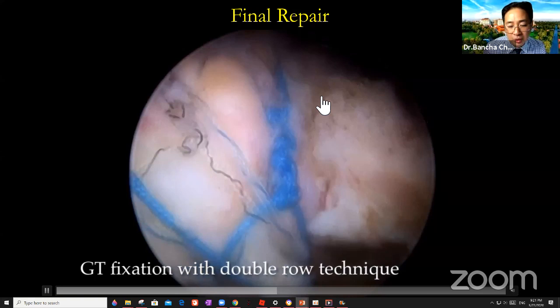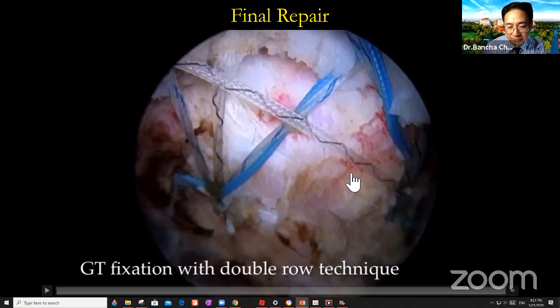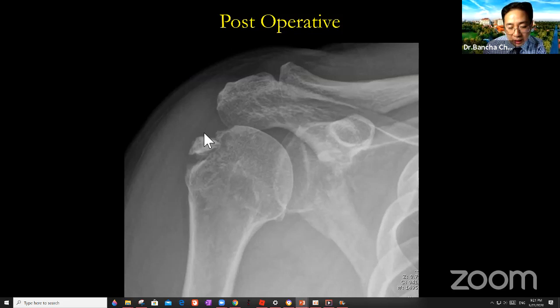After that, you get this repair. The tuberosity fits in the footprint nicely, but I still see some gap underneath. This is a postoperative x-ray. The tuberosity is put lower than the head, about 8 millimeters. This is okay, but you see some gap here, because this piece of bone is smaller than the gap, than the cradle.